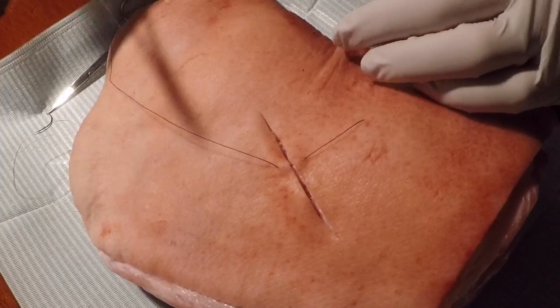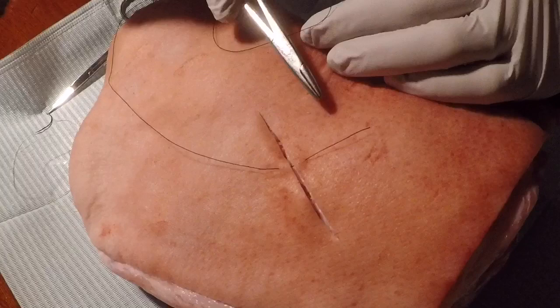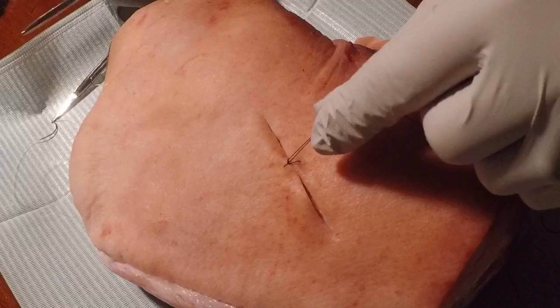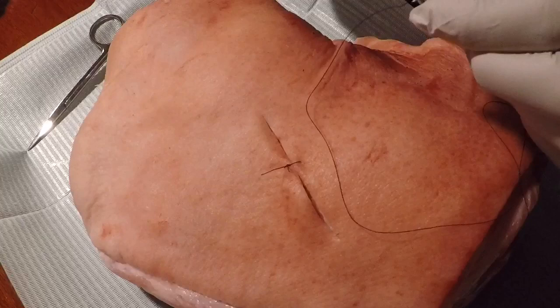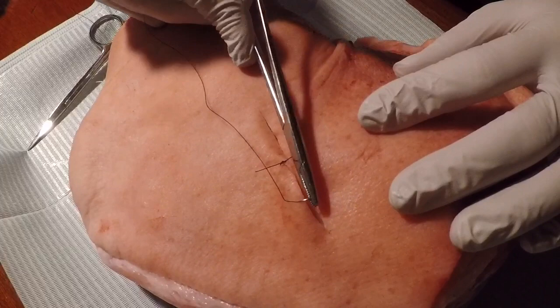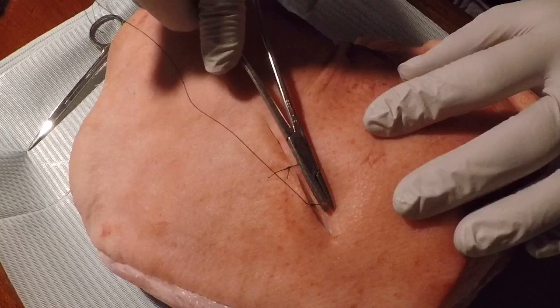If you have a big wound and you just need to close it without worrying about scarring, what you want to do is simple interrupted, which is the same as you did inside. Start in the middle of the wound first to get closure there, and then go closing the rest from that point. Pull it together and tie it the same way. The internal sutures were cut very close, but these you'll cut and leave a bit of a tail. If you cut them too close, they tend to come untied. Deep sutures you want to go away, so that's not a big issue. The external ones you want to stay, because they're going to keep the wound from opening up on the outside. Use absorbable inside because no one's going in there to get them out, and non-absorbable for the outside because you want to control when that's going to happen.